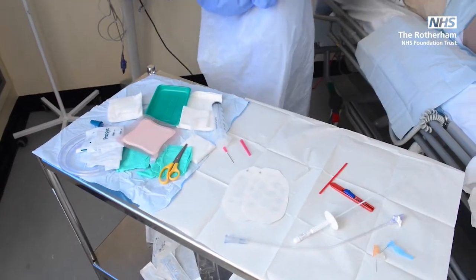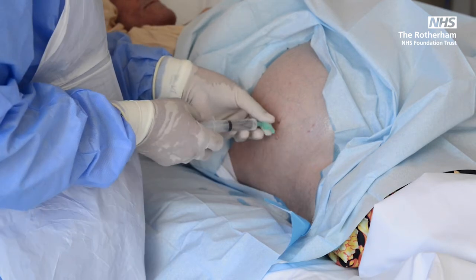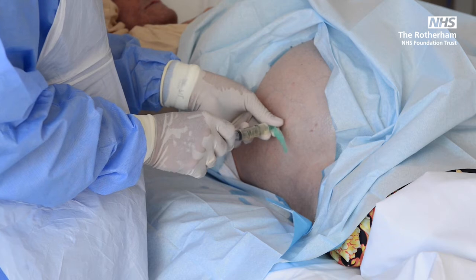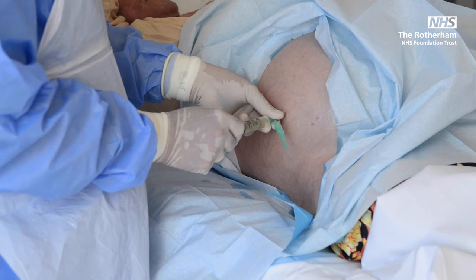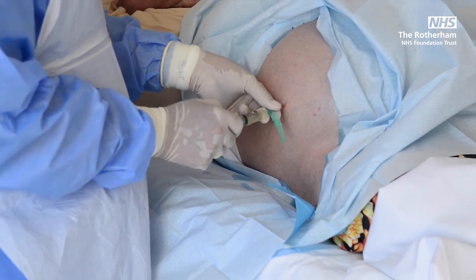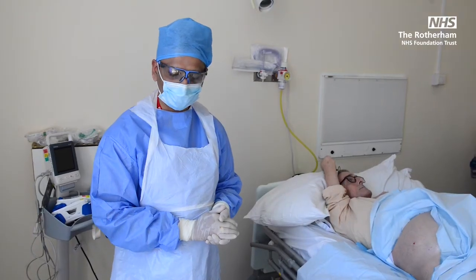Next is your green needle. Another sharp. So I'm already getting the flash of the ascites here. So withdraw a bit and then inject your lignocaine there. So you're actually anesthetizing the parietal peritoneum. We'll wait for another 2-3 minutes until he's completely anesthetized to that area.